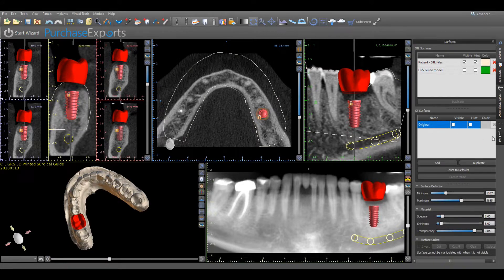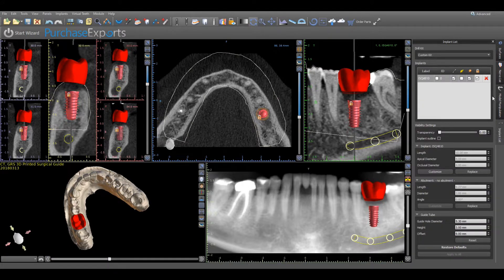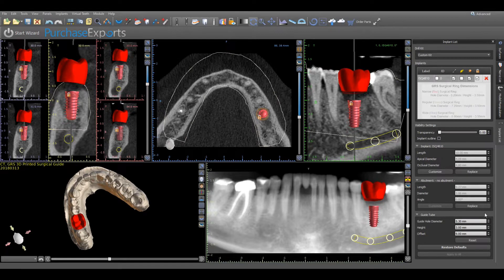Click on the Implant List tab on the Open Panels menu on the right and select Custom under the Drill Kit heading. The guide hole diameter and height dimensions need to be manually entered in the Guide Tube subpanel in order to have the correct guide tube dimensions for the GRS surgical rings.